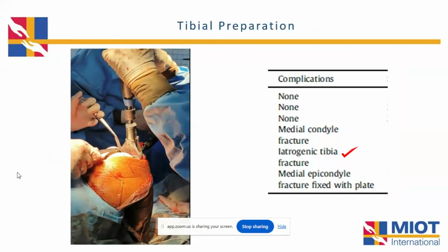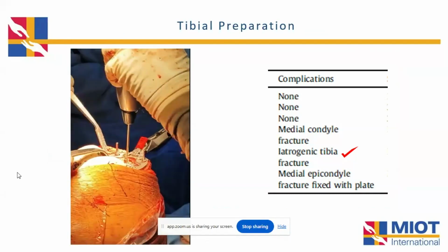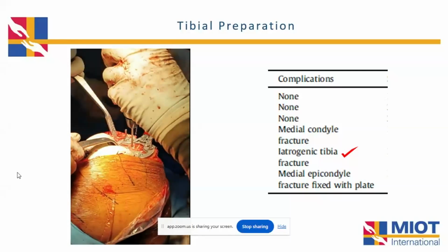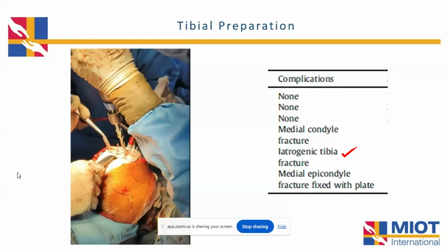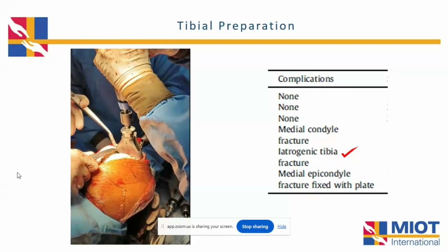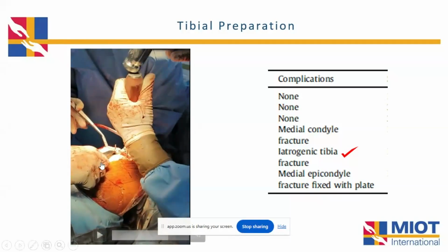In the tibial side, we had difficulty in preparing the tibial stem and the keel. So if you see here, we have been trying to drill, but the drill was not going. So we used the drill bits and put multiple drill holes. And to avoid necrosis, we were constantly irrigating with saline. And then we managed to drill. And the main thing is when you prepare for the keel, this is where things can go wrong very badly because of the brittleness of the bone.